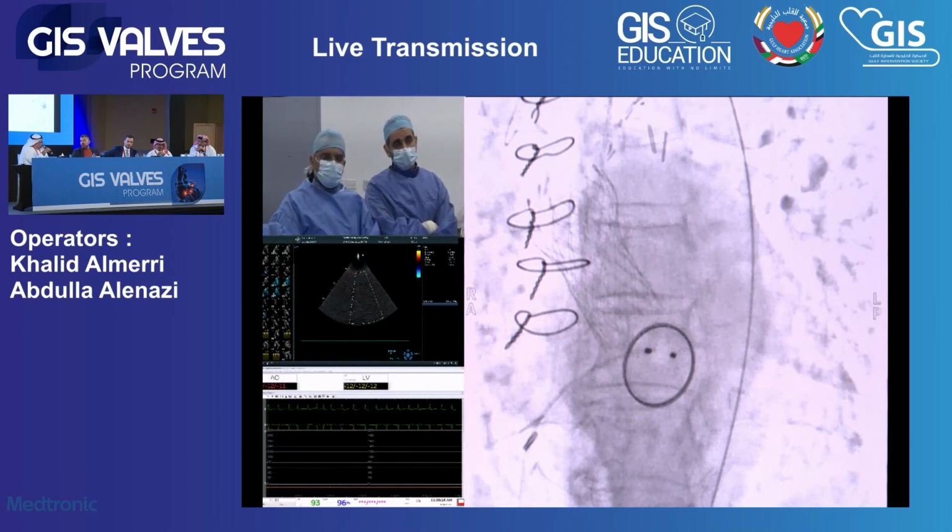To be honest, I think we found that ultrasound is sometimes time consuming. And regarding the calcium issue, you should know this from your CT. So you should plan this ahead of time. So I think we'll come across a debate here now about who is in favor of ultrasound or CT. Can we add one small comment here, Khalid?